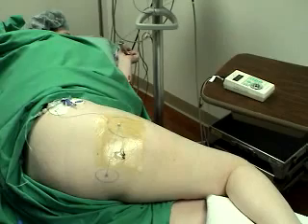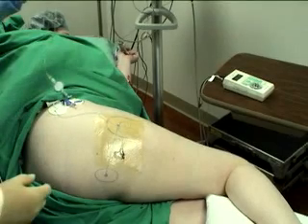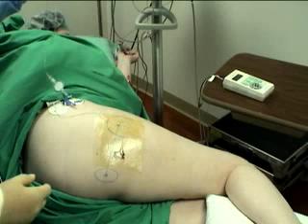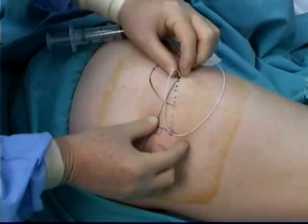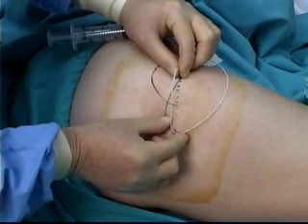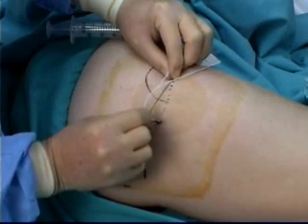The catheter and snap lock are placed in the stab lock, which is placed in a convenient position on the patient's hip or abdomen. The catheter exit sites are covered with a transparent dressing to allow daily inspection. If the small silicone tubing is lost or not handy, the catheter itself can be used to protect the skin under the skin bridge, as in this demonstration.